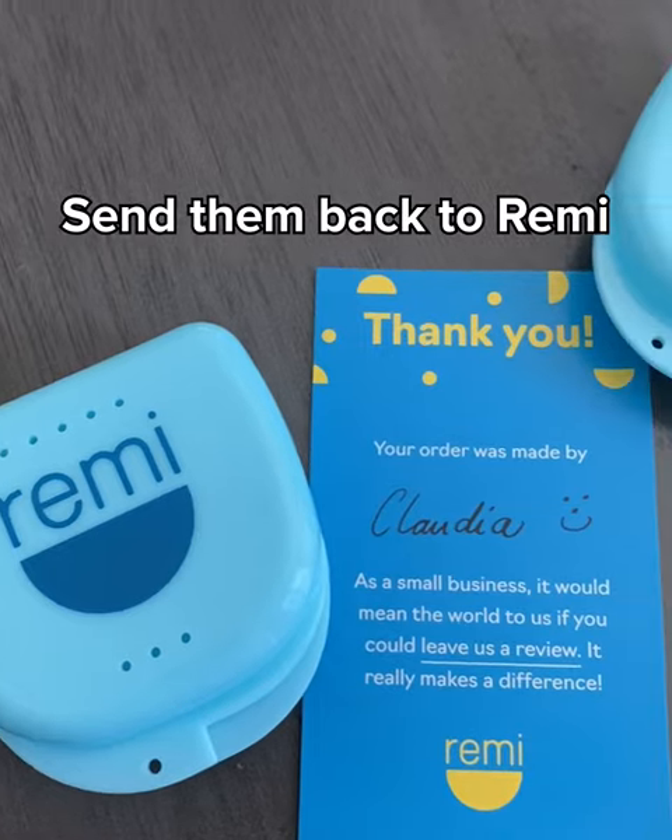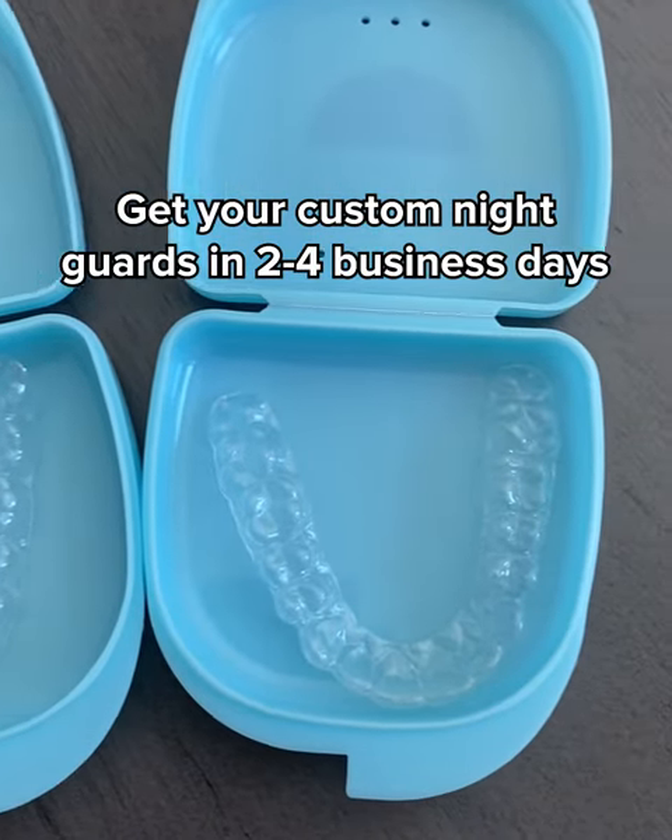Once you have your impressions, you send them back with a prepaid label, and a few days later you get your final night guards. Good night.